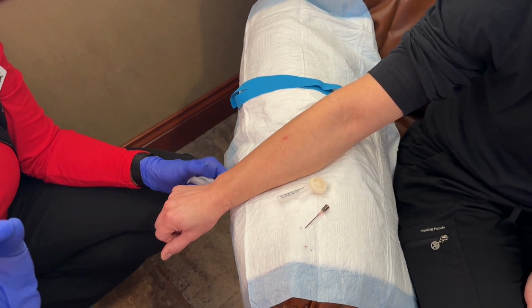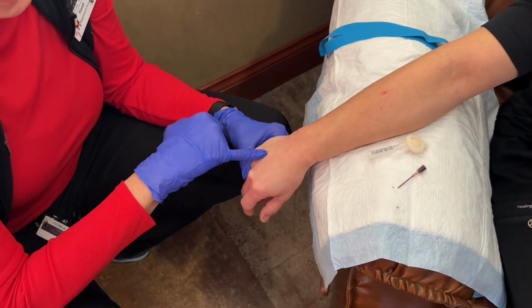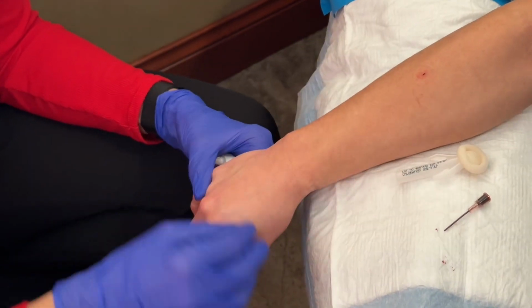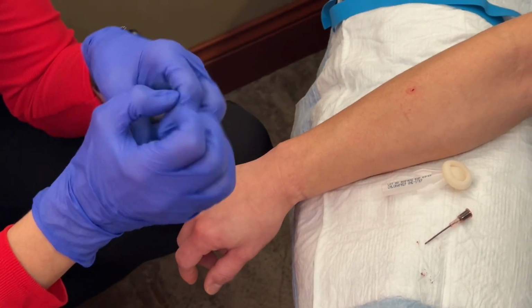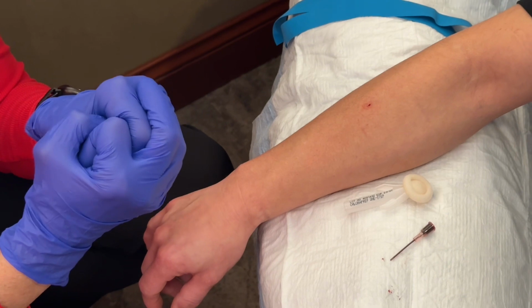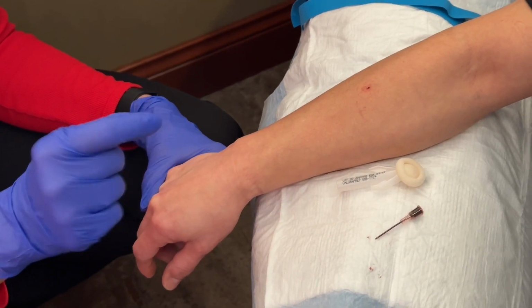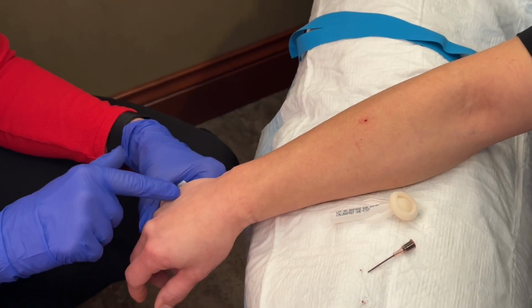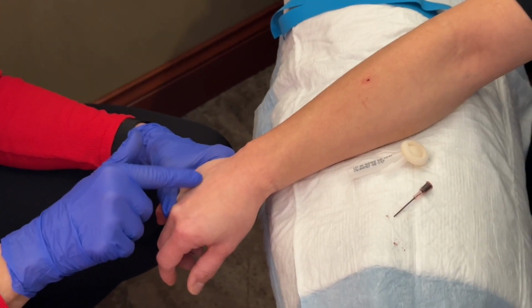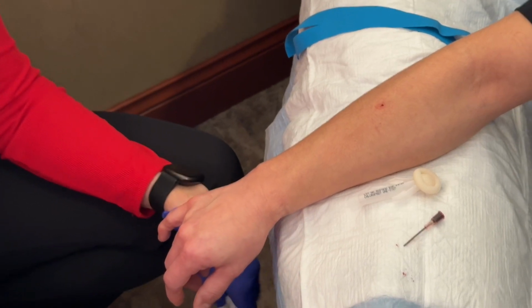Your gray area is the elderly who have that really loose, crepey skin. Let's say we were going to go into Steph's hand right here. Sometimes those people that have that really loose skin, or you see them come in with petechiae, easy bruise, skin tears, sometimes when you go in with that lidocaine, you'll just see it go whoosh, like a flood. It sometimes will not make a perfect little wheel. So try and slow your injection down. I never inject lidocaine really fast. I do it very slow because you do not want to lose your vein. And I very rarely will lose someone's vein. If it starts to spread like that, just stop, maybe pull that needle out a little tiny bit and see if you can get a wheel. But most of the time, those are a little bit trickier just because it will spread. But they'll still get numbing stuff on board.